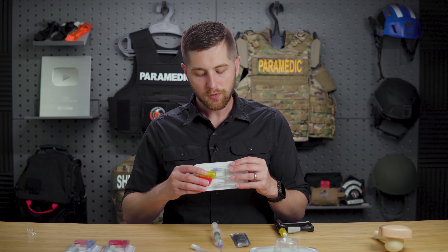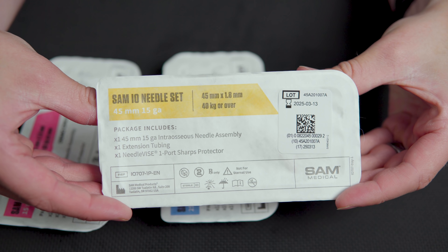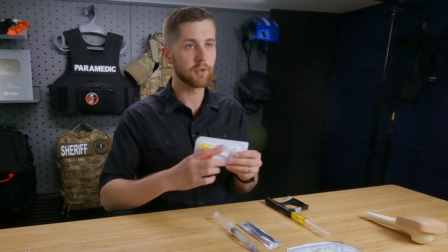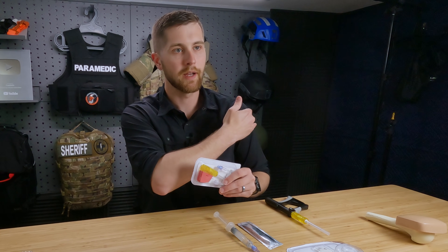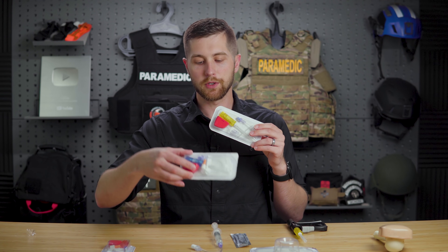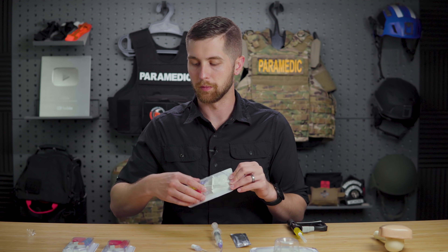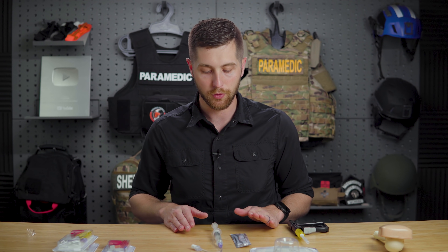Last is the yellow needle — a 45 mm, 15 gauge needle, recommended for patients 40 kilograms or more. This is often good for proximal humerus insertions because there's a bit more adipose tissue there even in non-bariatric patients. And you can insert this on relatively small patients — if you tried a smaller needle and it fails, you can go to this and still insert it successfully; it will just stick out a bit farther.